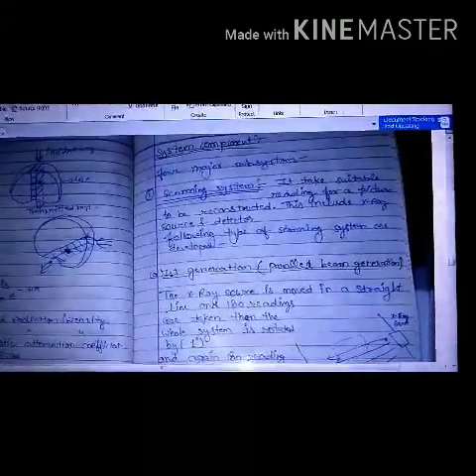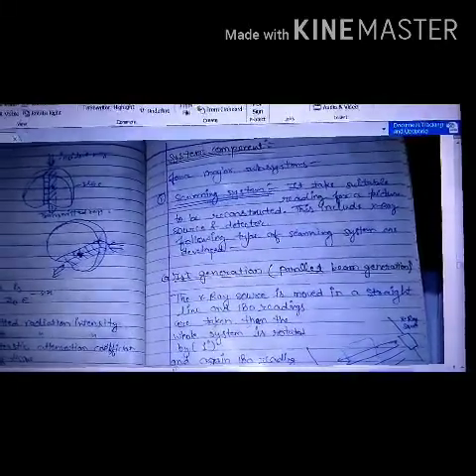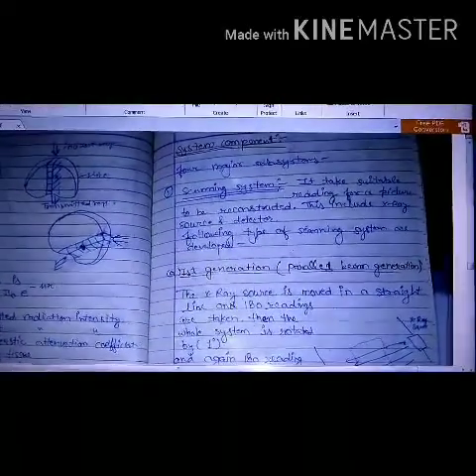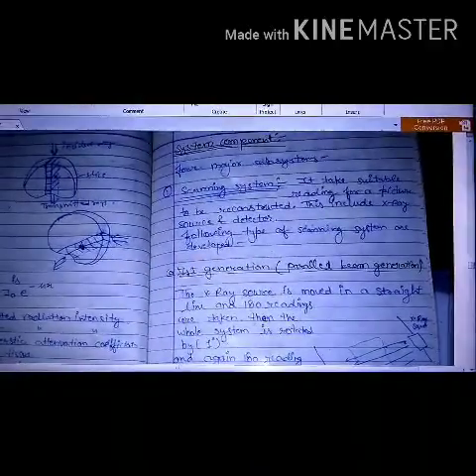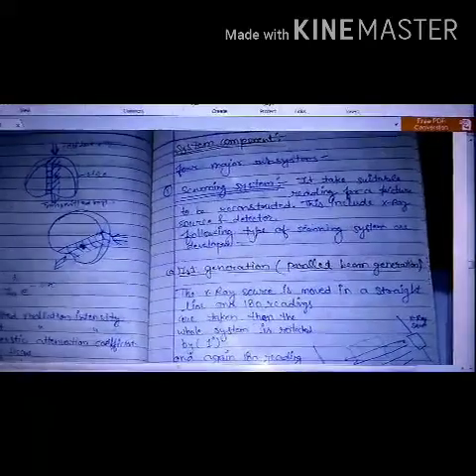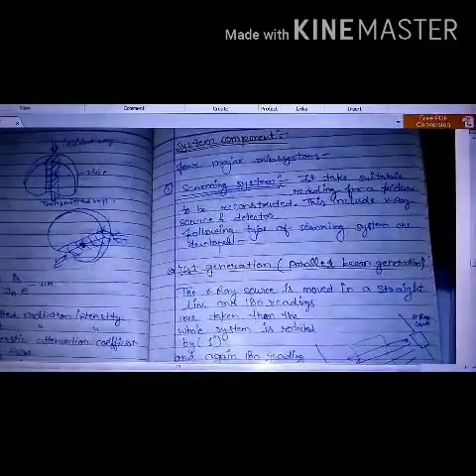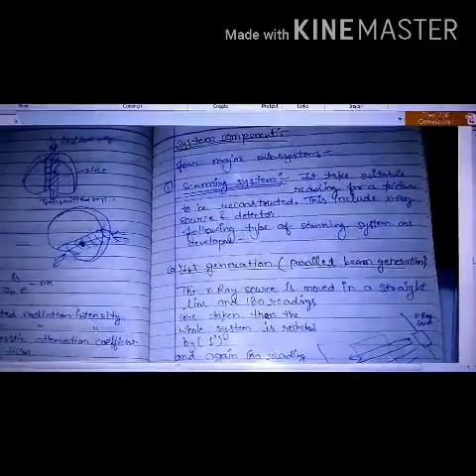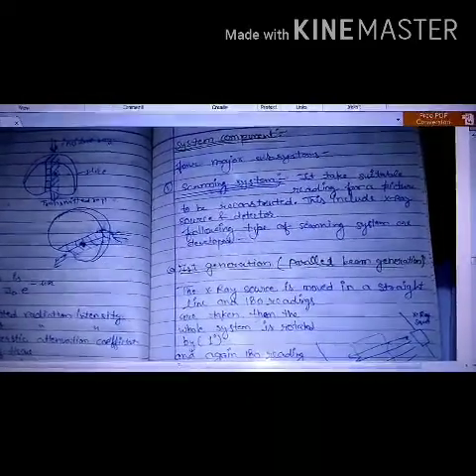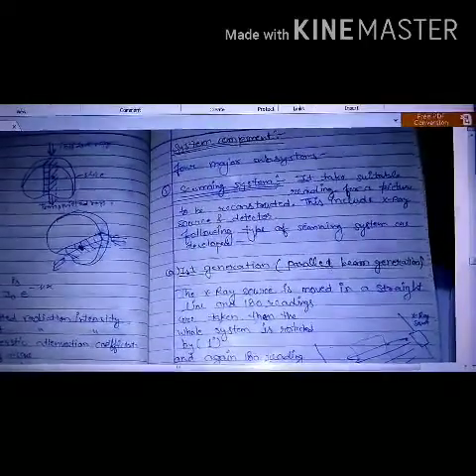In the previous lecture, we have looked at X-ray based computed tomography and its basic principle of working. Here we are going to look at the different components which are included in that basic CT scan based tomography. This system basically consists of four major subsystems. First one being the scanning system, second one being the processing system, third one being the viewing system, and fourth one being the storage system.